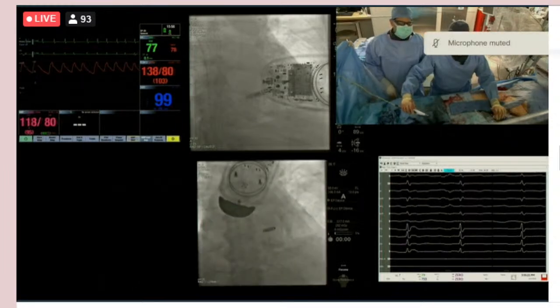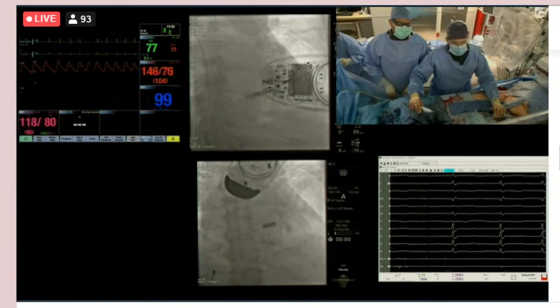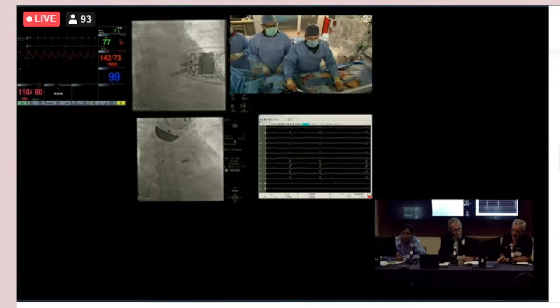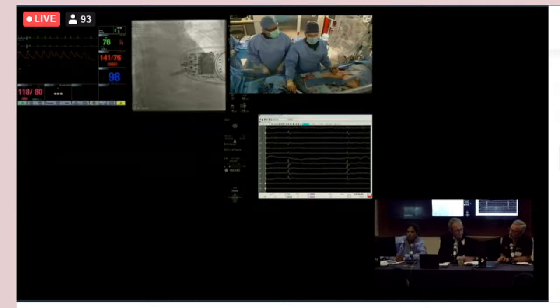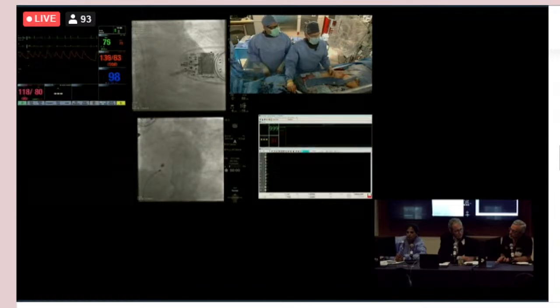There's a question. Okay, hang on a second. Before we let you guys go, the question is how much LAO is sufficient? I got a 40 degree, but go LAO again. What I like to do is that the pacemaker should be looking right at us on an LAO view, just like that. And that's about a 45 LAO.